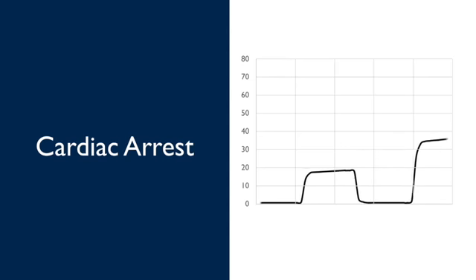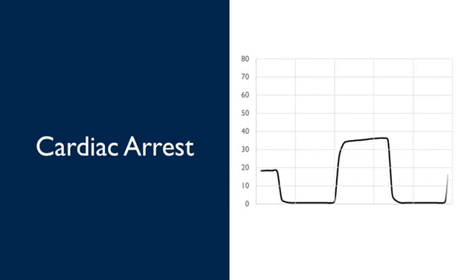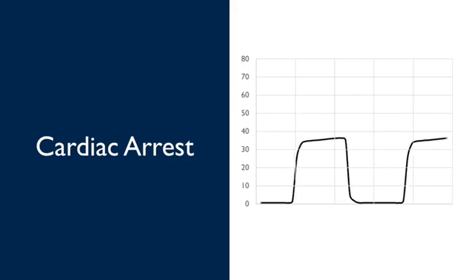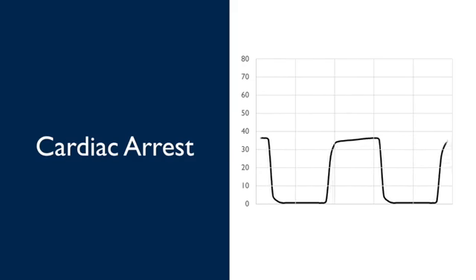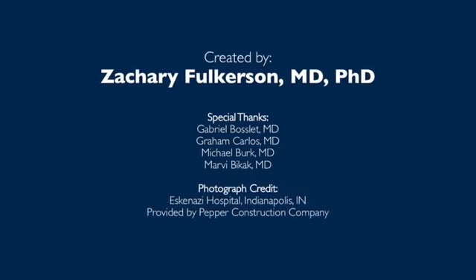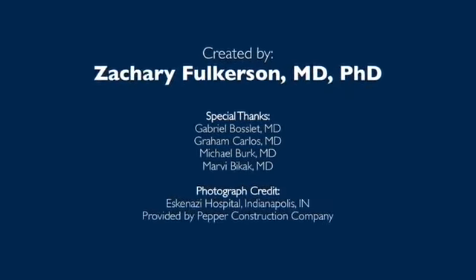I particularly love capnography in the immediate post-arrest phase because I know that as long as my patient has measurable end-tidal CO2, they also have spontaneous circulation. This concludes our review of waveform capnography. I hope that you have found it useful.